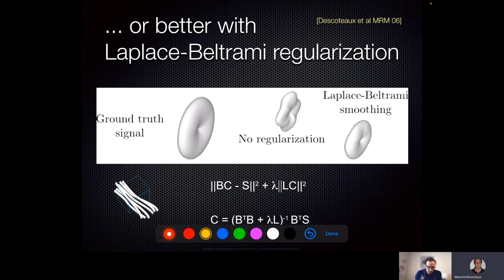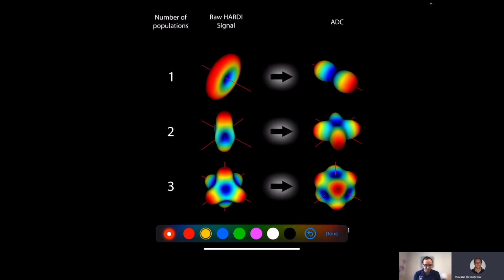There's also, in practice, a small regularization parameter coded in DIPY. So this is why it's called the pseudo-inverse smooth. This comes from several papers and years of research. You shouldn't really have to play with that, but it's good to know that we do actually have a small regularization just to stabilize the spherical harmonics transform.